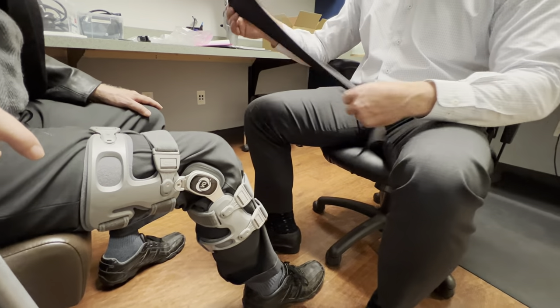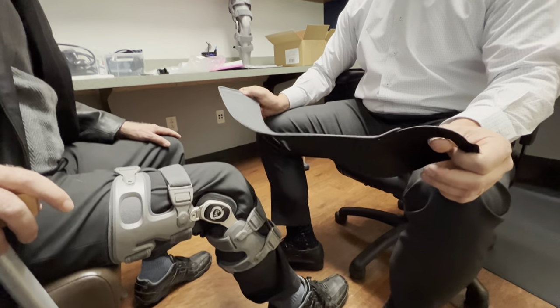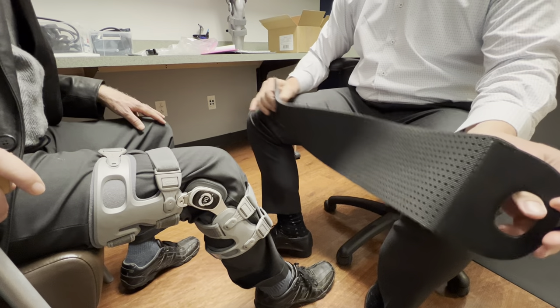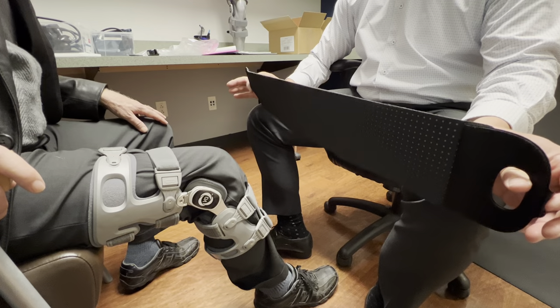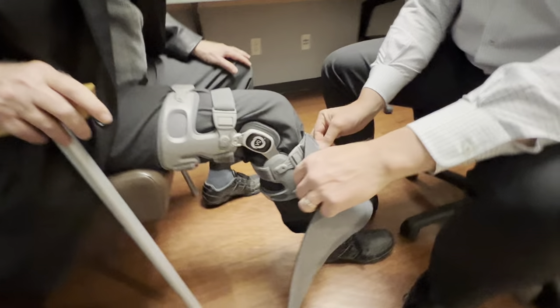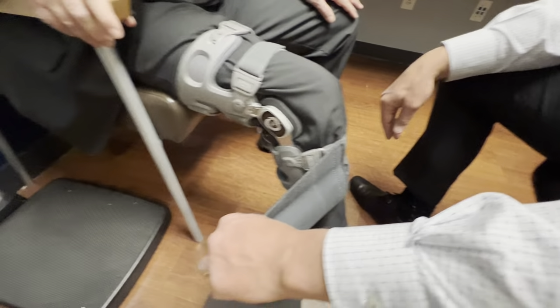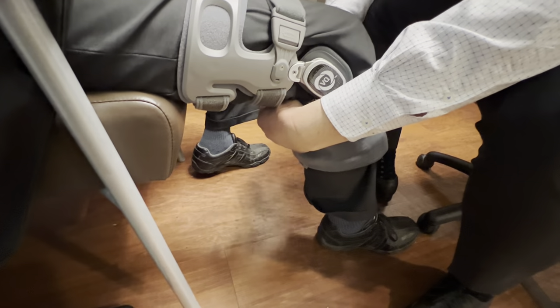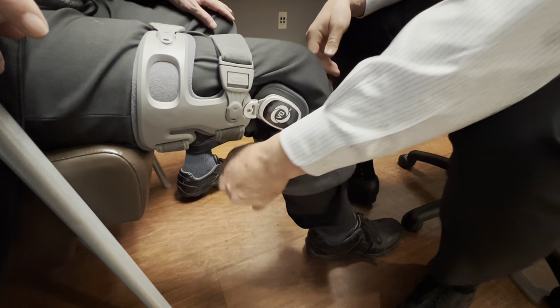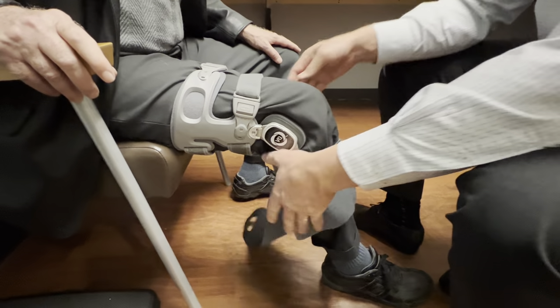This is called a suspension sleeve — every patient gets one. I can't tell you how many patients have come in with their brace on and aren't wearing it. This is super important for holding the brace in position, so you must wear this with the brace. It'll work much better and you'll be happy wearing the brace with it. This velcro here attaches to the outside of the straps and we always want to pull from outside to inside so we don't pull the brace out of place.